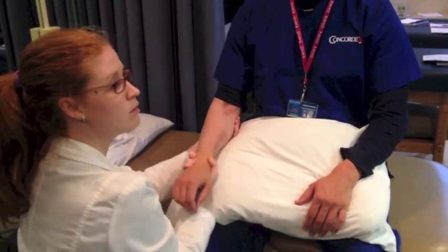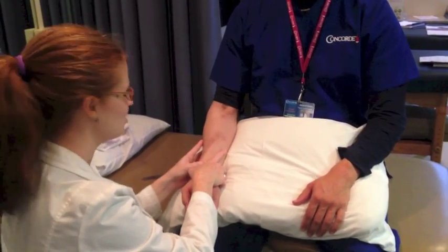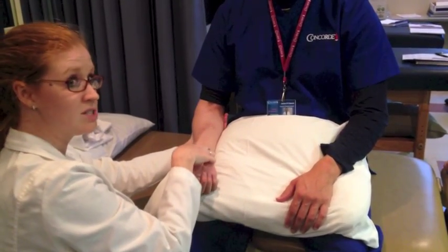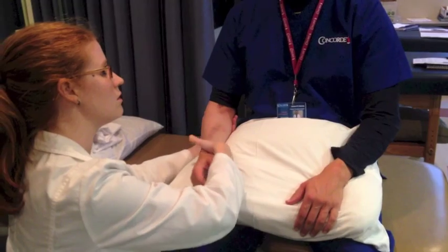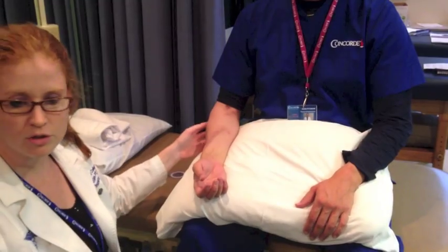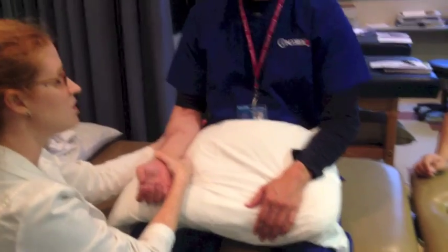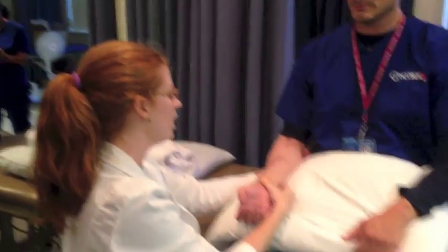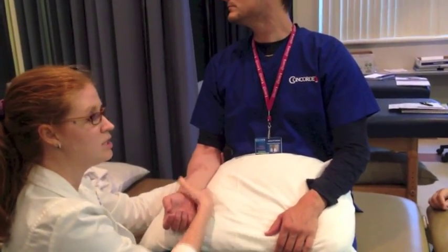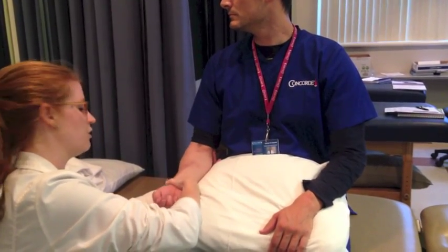Pronation and supination — proximal radial ulnar and distal radial ulnar. We're going to measure distally. This is, I would say, the strangest of all the measurements we're going to do. Notice how I'm stabilizing the elbow. I'm not stabilizing the radius and ulna; I'm more stabilizing the humerus and letting it fully pronate, then taking it back into full supination.